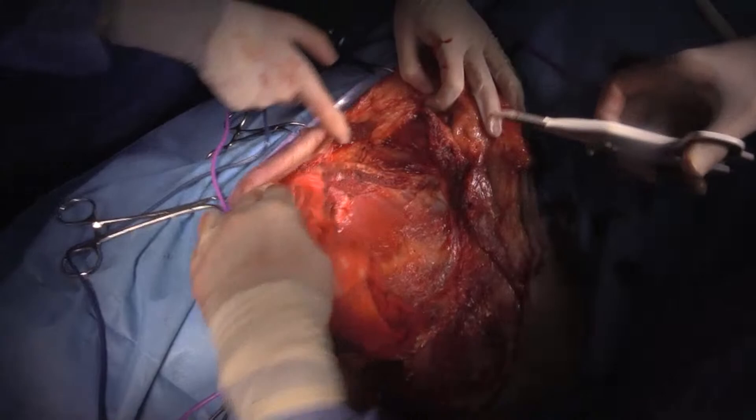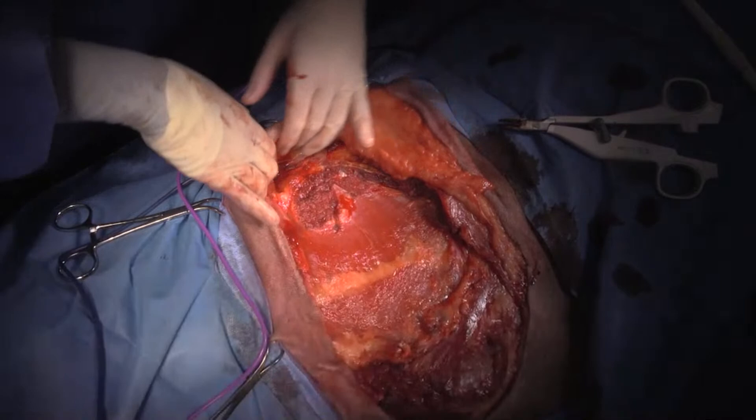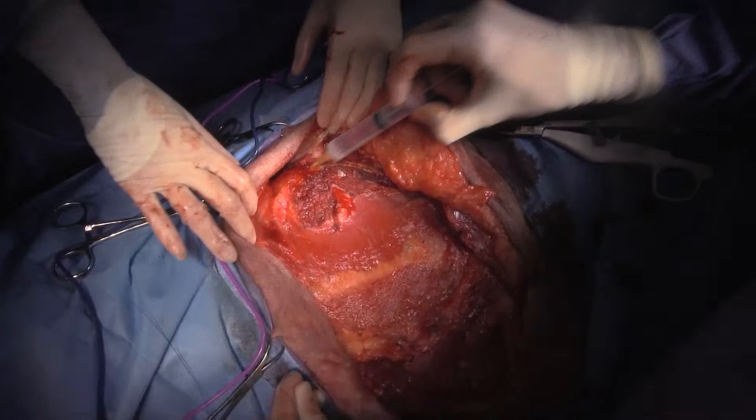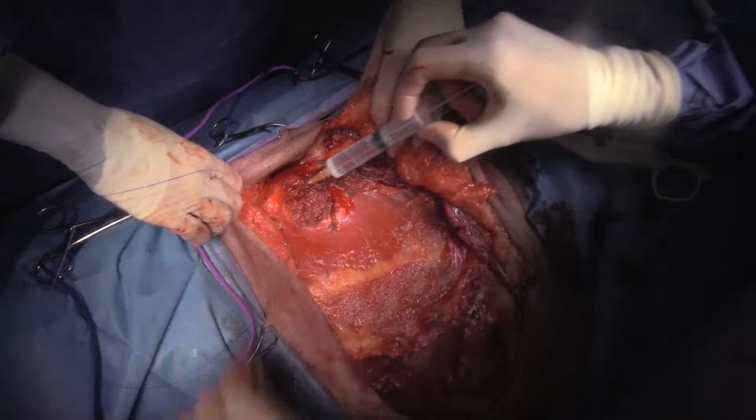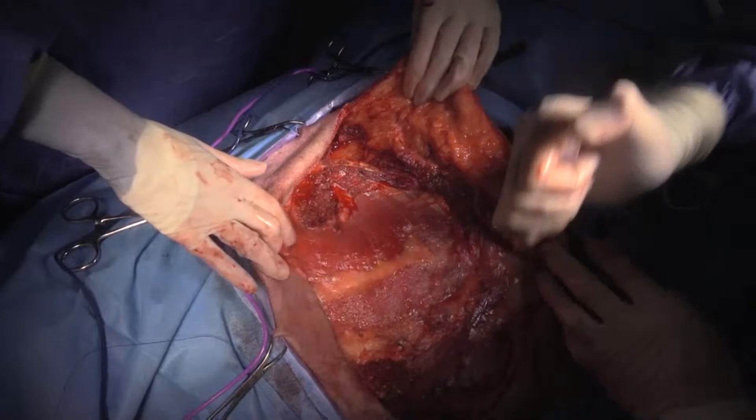So now what we'll do is get the rest of my mepivacaine and inject it into the muscle bellies — into the trapezius up here, for the serratus ventralis here, latissimus dorsi here, and the pectoral muscles down here. Can I get some O-PDS, please?